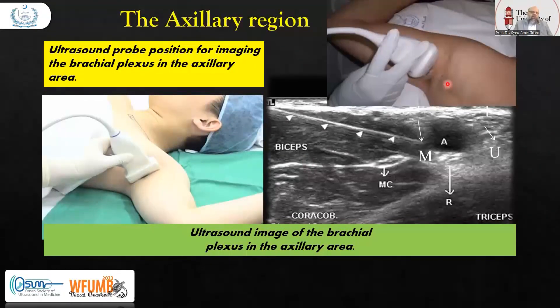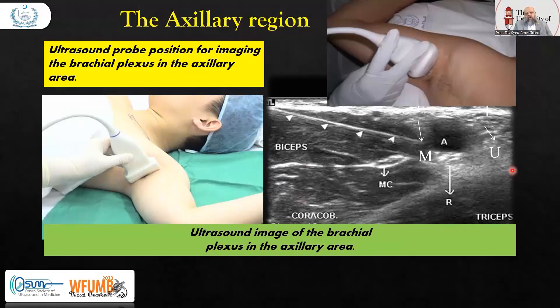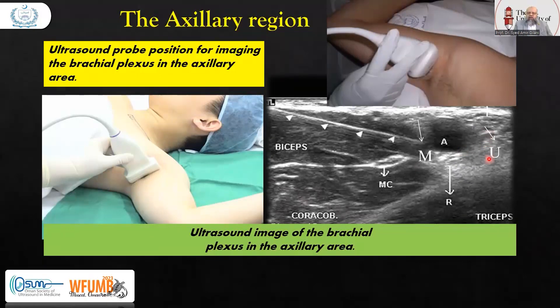Then we move to the axilla. In the axillary region, the probe is placed transversely. Here you can see the axillary artery with the biceps. We have the ulnar nerve, radial nerve, median nerve, and musculocutaneous nerve. Along with the axillary artery in the axilla, on three sides, we can identify the origin of the ulnar, median, and radial nerves from the brachial plexus.